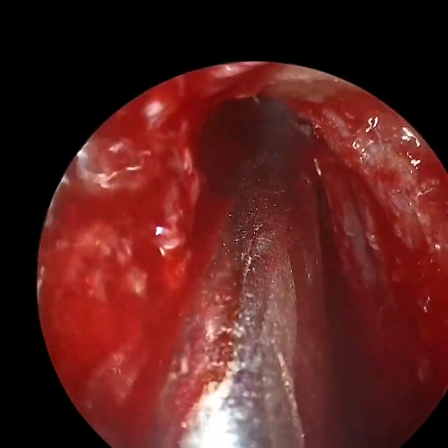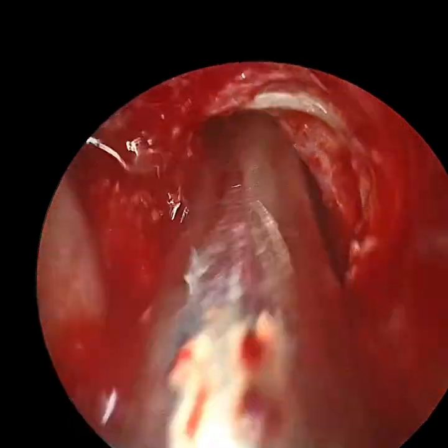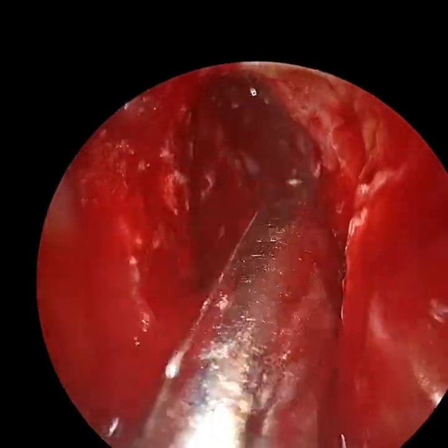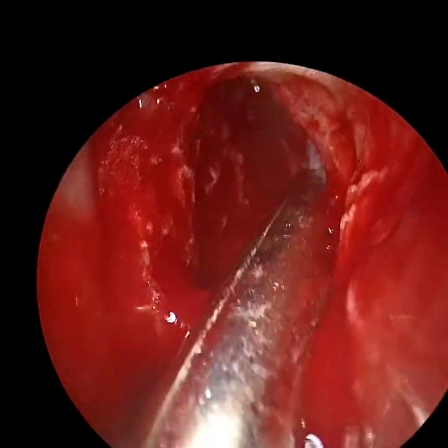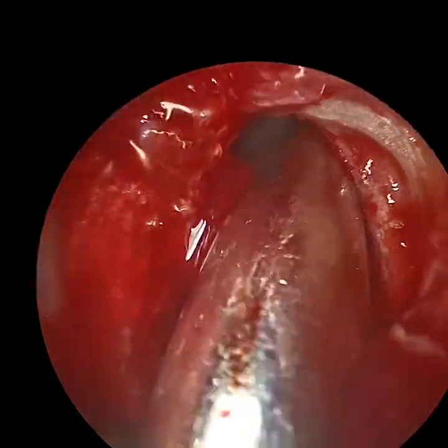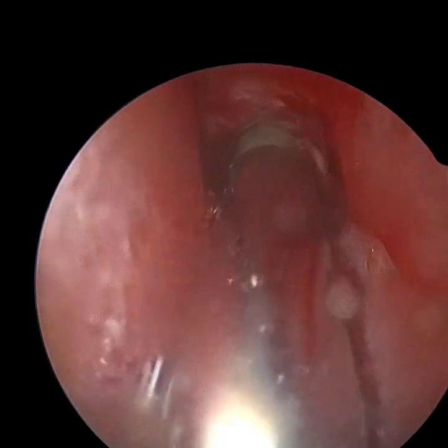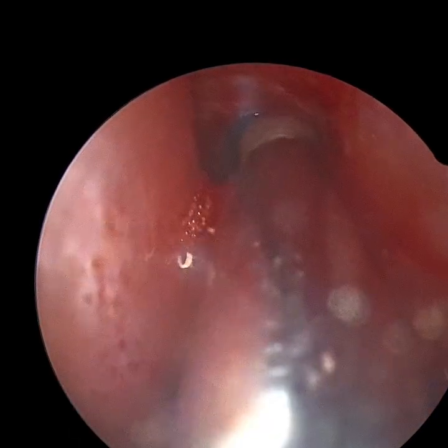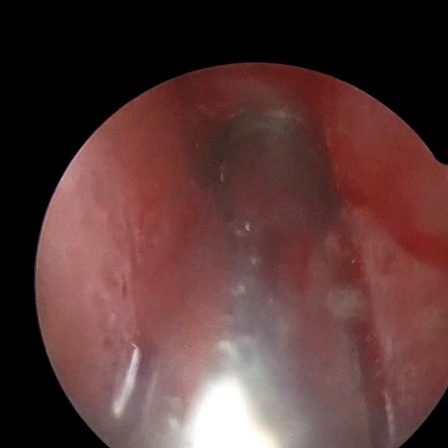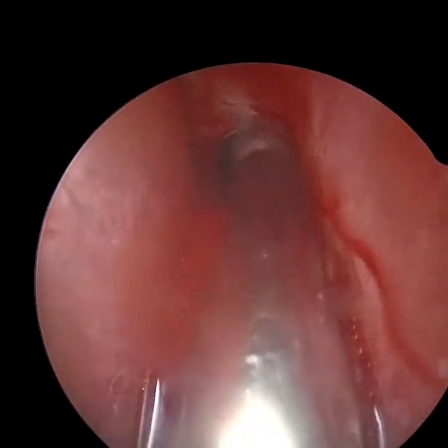And then with the curved debrider, we are able to go inside the frontal sinus and then remove the disease from the frontal sinus. And once we remove the disease from the frontal sinus, we make sure that everything is fine and we have a nice opening into the frontal sinus. And after that, we do a little bit more drilling so that we can place the mometasone stents here.